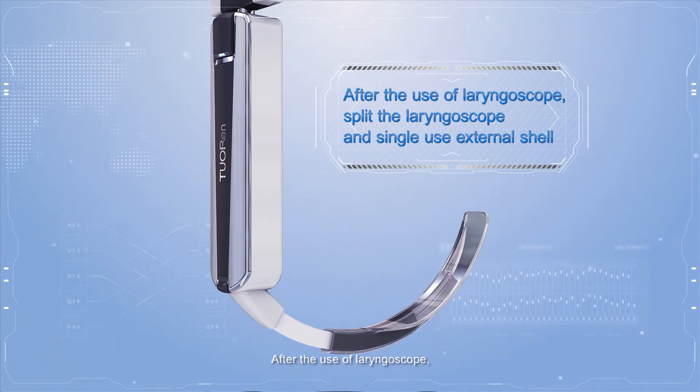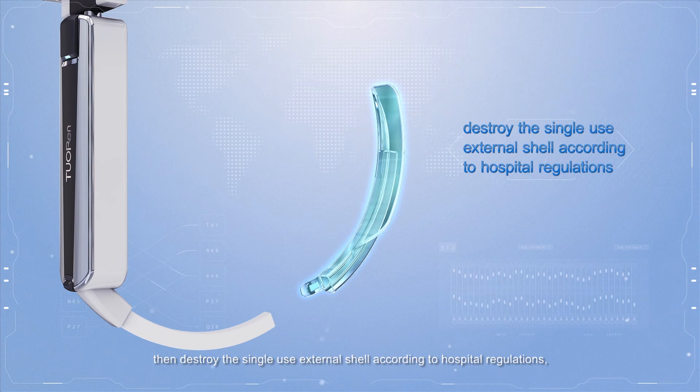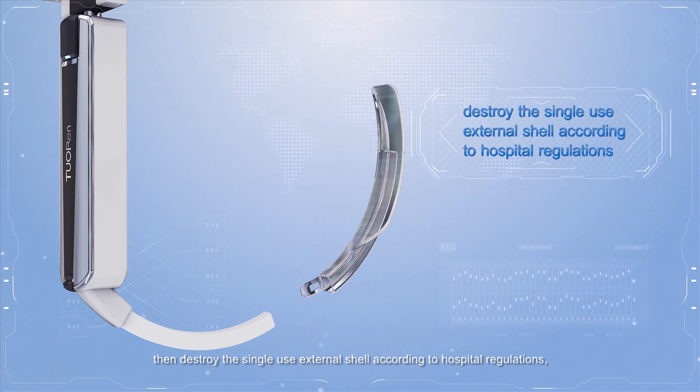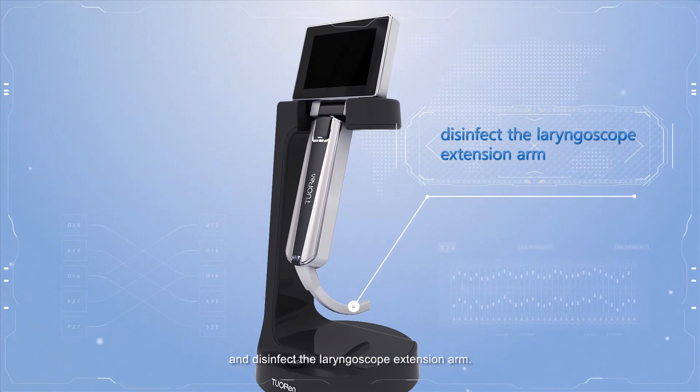After use, split the laryngoscope and single-use external shell. Destroy the single-use external shell according to hospital regulations, and disinfect the laryngoscope extension arm.